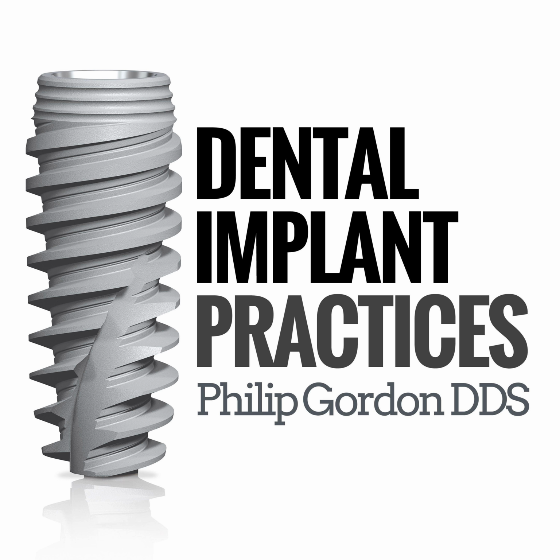So you can get into straight multi-units. You can get into tapered multi-units, 17 degrees or 30 degrees, and these allow combining implants with full arch zirconia at different angles. So at that point, there are multi-unit accessories, which allow you to make temporaries, take impressions, and all types of complicated processes there with full arch dentistry.